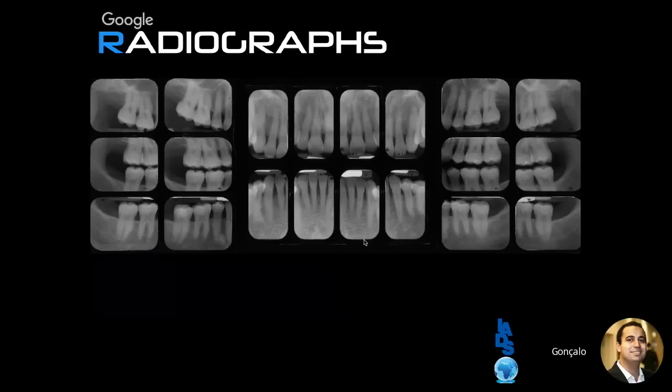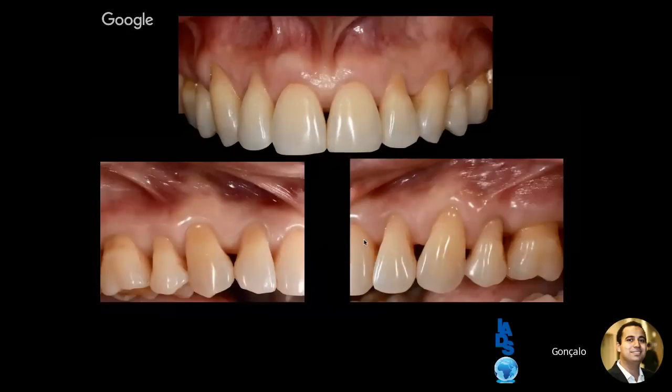She had shallow pockets from 3 to 4, but of course you can see, although we don't have severe bone loss, we have mild to moderate horizontal bone loss, and that makes it less predictable to treat. You can see these black triangles, so we won't be able to close those black triangles, and the patient has to understand that we can improve, but we cannot completely close them because we have bone loss, we have attachment loss.